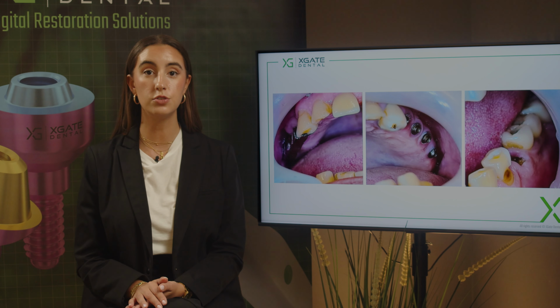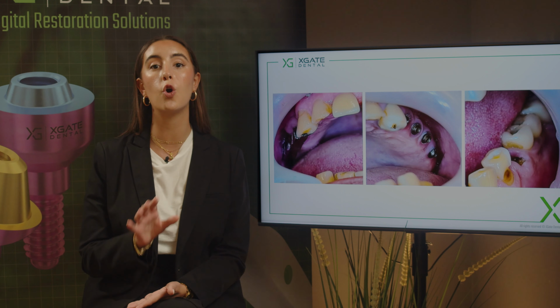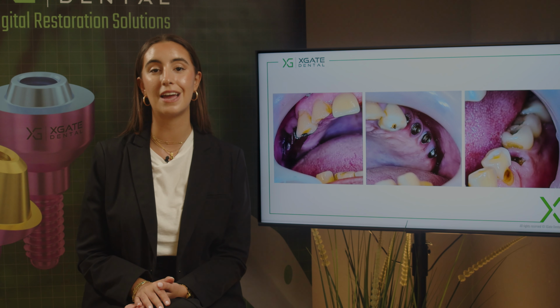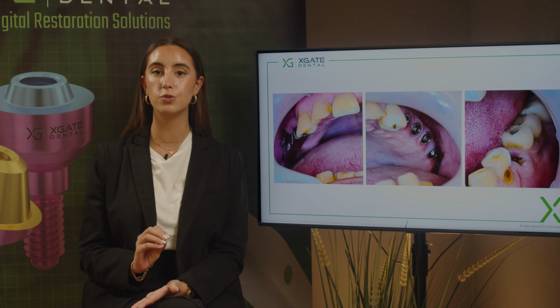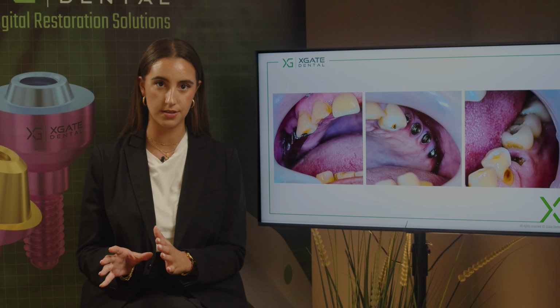You need to extract the tooth, and we have a bar on 2 multi-units and small partial denture, overdenture on this bar. We have 4 crown bridges on 4 multi-units and 4 implants, and we have 2-unit bridge, 2 premolars on 2 implants. And you can see already that the implants are very close to one another. So we know we'll have a problem in the impression taking process.